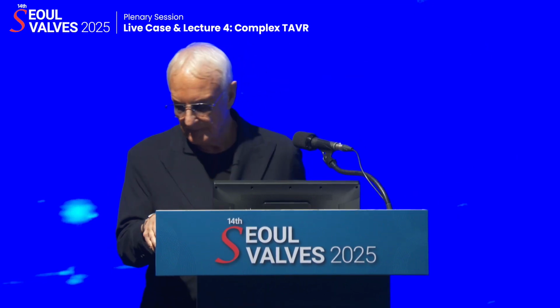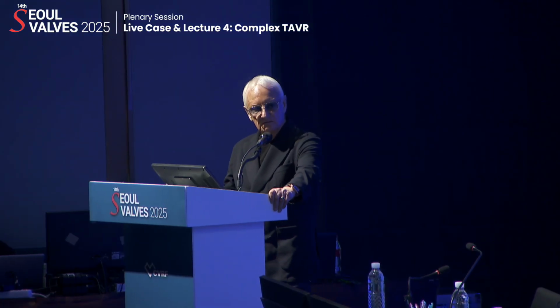Okay, thank you. I'm a guy of the DES era, but I was told that there are so many different devices, different mechanisms to reduce restenosis. But nowadays, after DES was introduced, every other device is gone. I think that's exactly what we are seeing going on in the mitral and tricuspid field, because there are so many devices with so many different mechanisms. So, from your perspective, which device will prevail eventually? Valve replacement or TriClip? Or do you think we still need so many different devices?